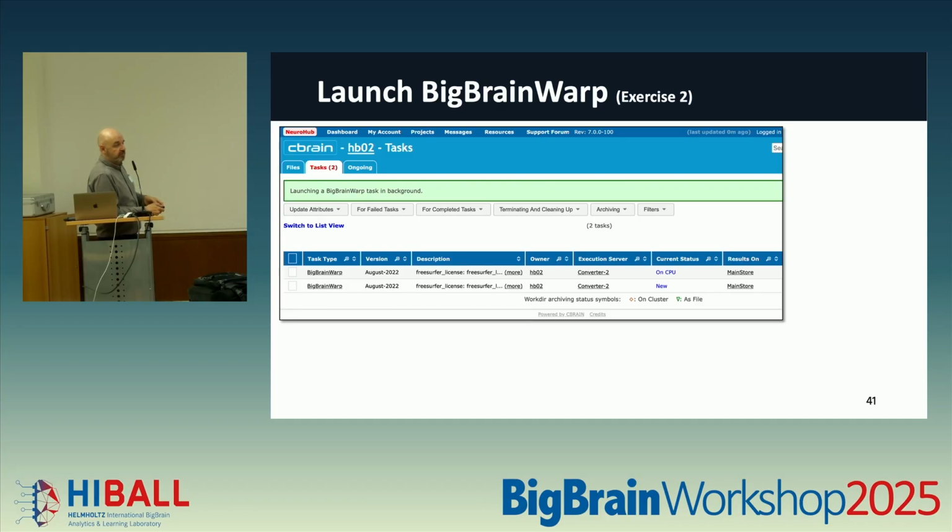Okay, so I'll give you a second to go through that. If you have trouble with the tasks or the project switcher, let me know. But if you just go up there, switch it, select the one that you created, and then you should see a task list view. In my case, I have 2 here because I had launched 2 at the same time. But in your case, you should at least have 1 in this with a menu of information here.